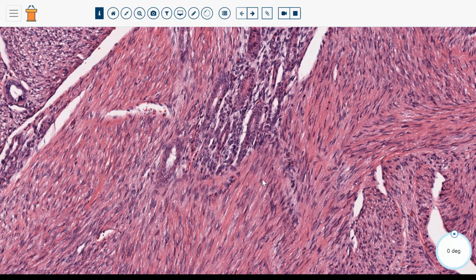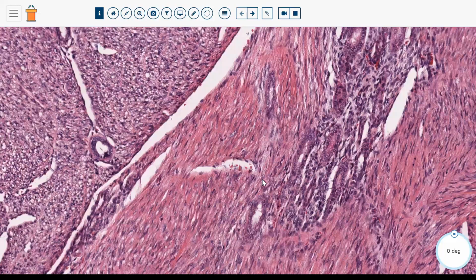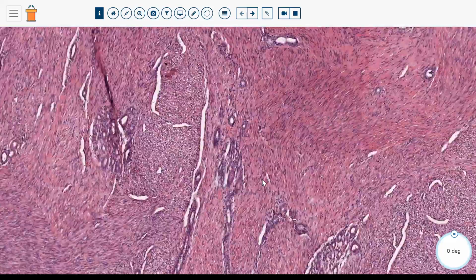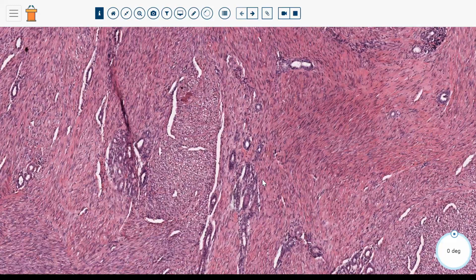Congenital mesoblastic nephromas are the most common congenital renal mass, and they overwhelmingly occur in children under 2 years of age, especially in the first year of life. Mesoblastic nephroma comes in two varieties. The classic type has a more uniform fascicular architecture with more cytologically bland spindle-shaped cells. And then the cellular type, which often has a greater mitotic rate, sometimes has necrosis, and is basically histologically identical to the entity infantile fibrosarcoma.